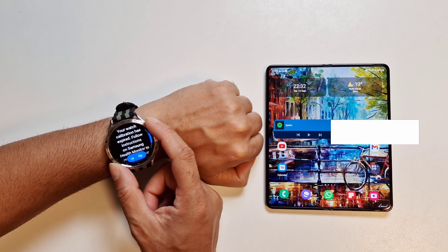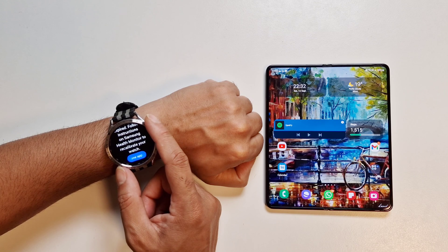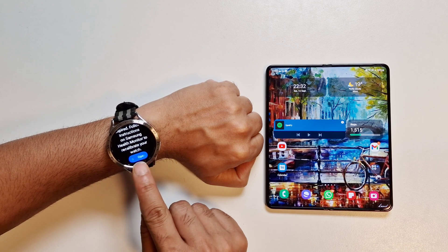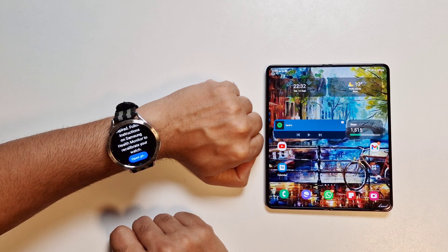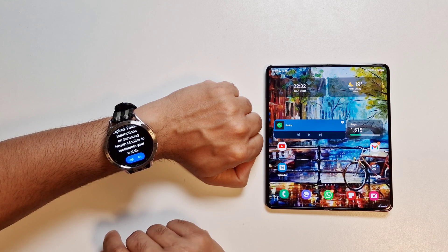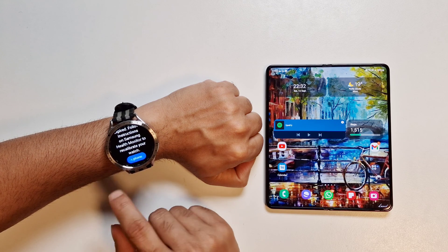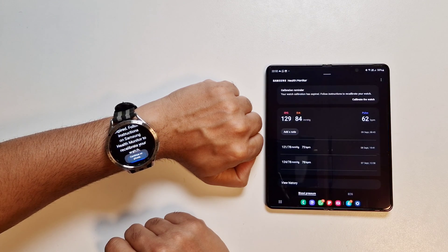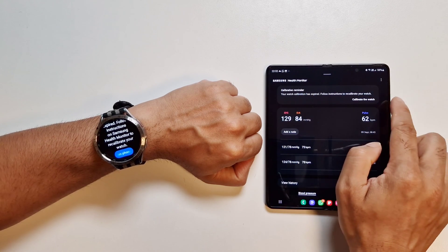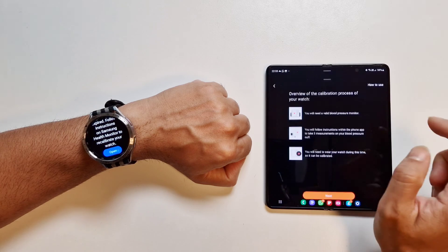Here it says 'Your watch calibration has expired. Follow instructions on Samsung Health Monitor to recalibrate your watch.' Tap the blue button to open. If you haven't installed it yet, yours will say to install it. Because we've already used it before and our calibration has expired, it's prompting us to recalibrate. You'll then open it up on your phone, which gives the same message, and then we just tap to calibrate the watch.